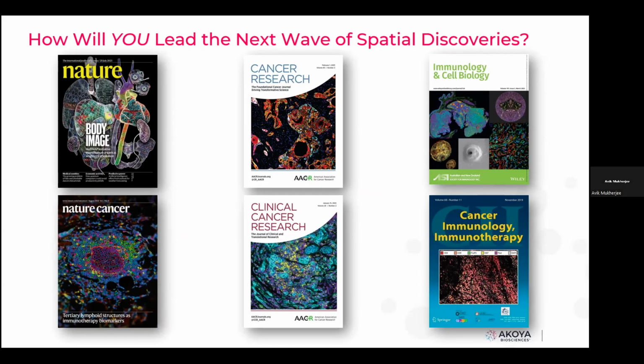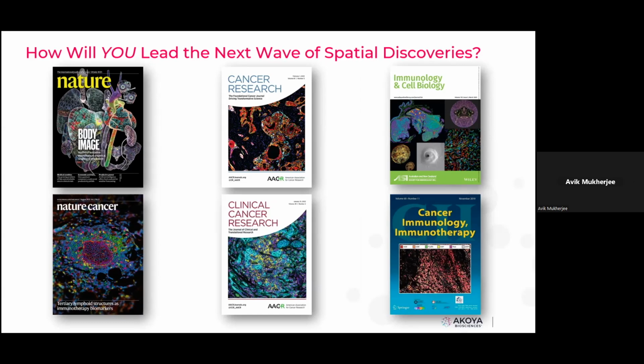Thank you. So you mentioned that this 10x study was done on the same slide? So yeah, this is Jackson Labs. They have put this protocol on protocols.io, where they took the Xenium, as you can do it with the normal slide. So they did the Xenium study on the same tissue. They came to PhenoCycler-Fusion and ran a protein panel, and that's the image that they put in for both. It's the same tissue. Xenium first. But like the same slide or the same tissue? Same slide, same tissue. And Xenium.